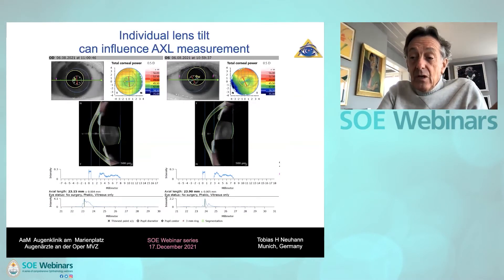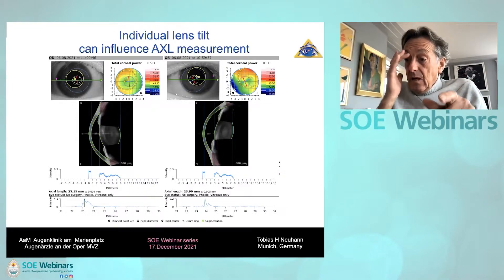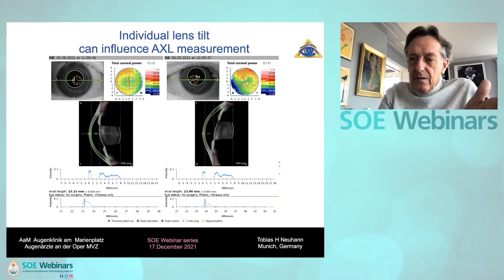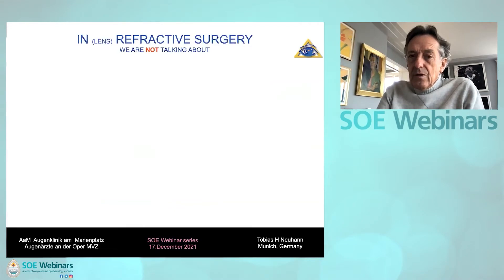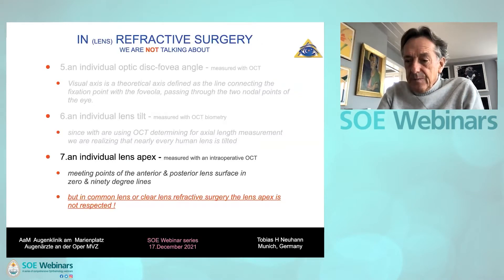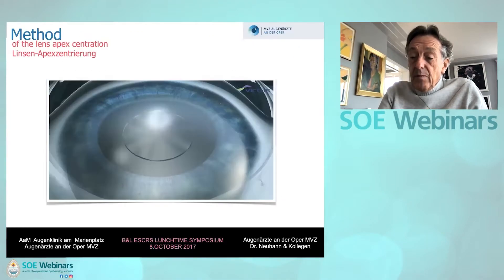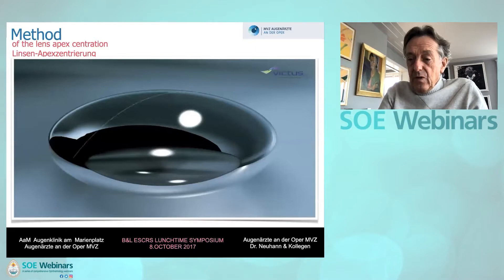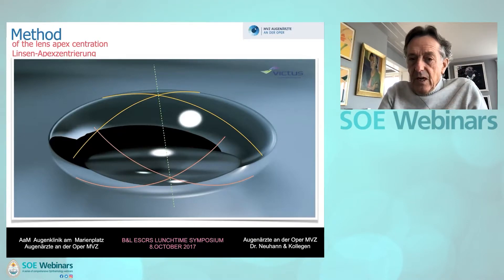With anterior OCT imaging, we see the individual lens tilt. Look at the precision of fixating the light in this upper image — this is something we couldn't see years ago. Today, the individual lens apex with its nodal point is calculated by the intraoperative OCT. Here we see the calculation of the anterior surface of the lens as well as the posterior surface, and the meeting points of the surface calculation are connected. Around this center of these lines, the capsulotomy is performed.